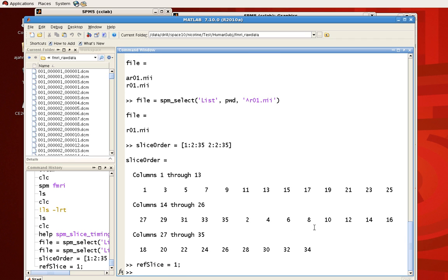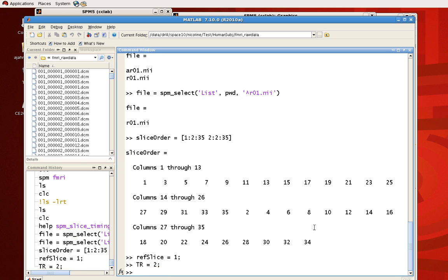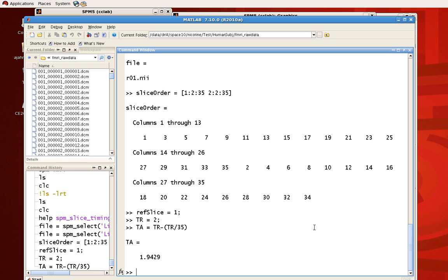Now for timing, recall that the first element of the timing vector is the spacing between the slices. Remember our TR was 2. Let's assign that. And our TA is our TR minus TR divided by the number of slices, which is 35. So about 1.94.